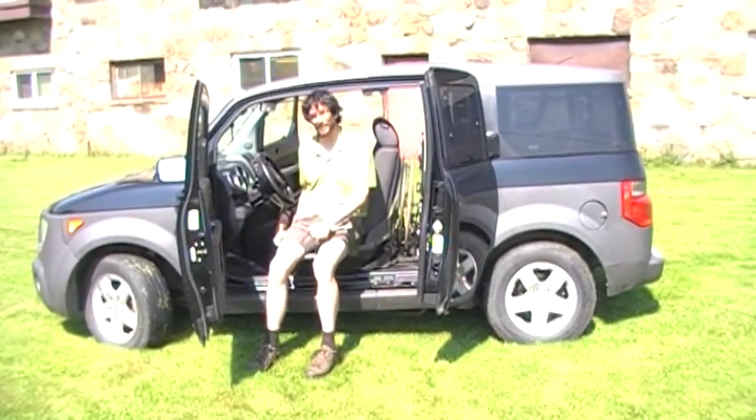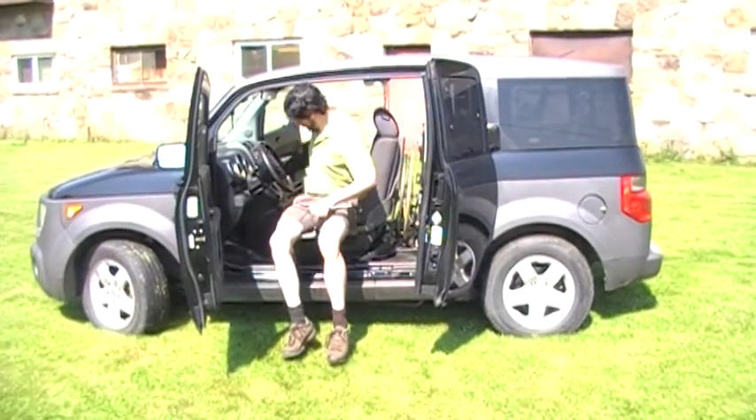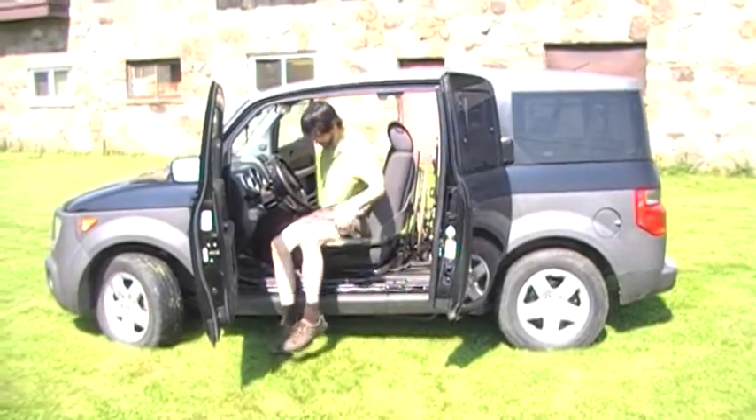Now we're ready to raise up. Once we're up level with the vehicle seat, we transfer over.